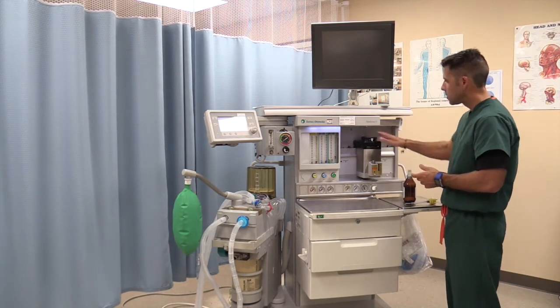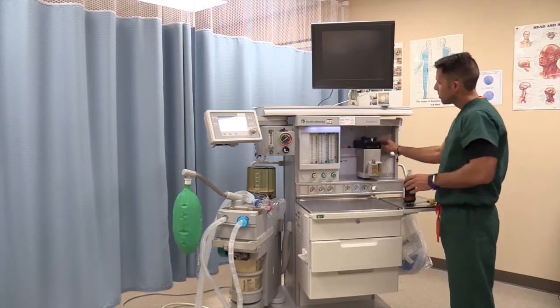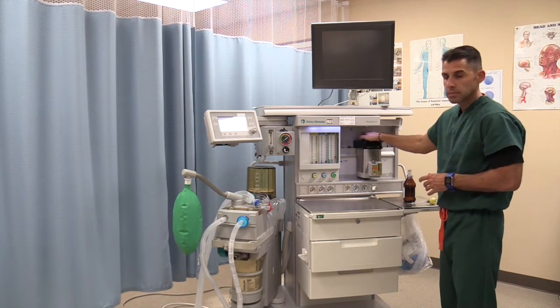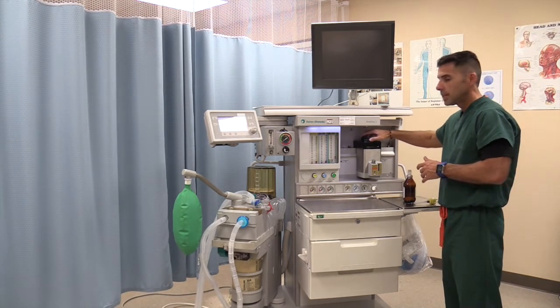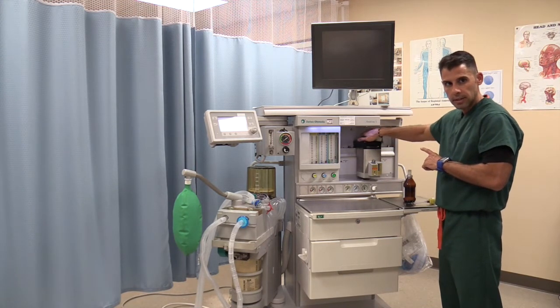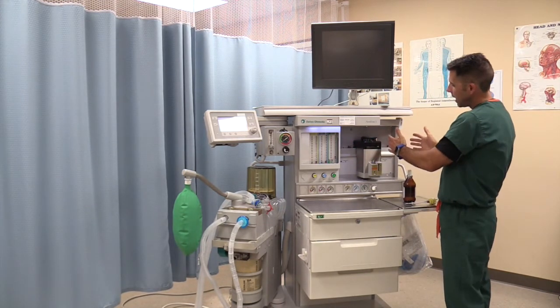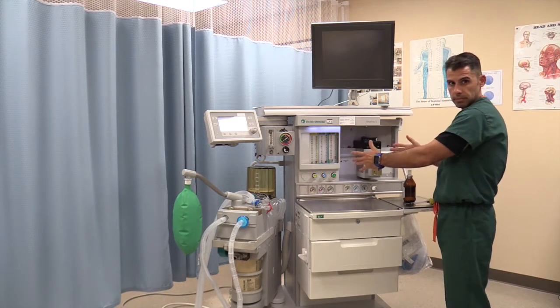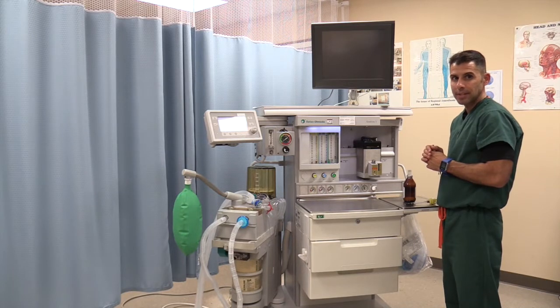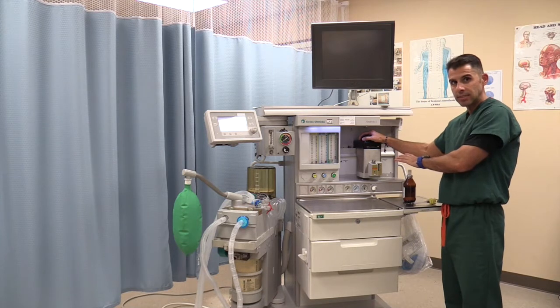In keeping with the anesthesia machine, once we lock the vaporizer, this is called an interlock system. It allows us to open the gas, and you will hear a little click every time you open it. Another safety feature is that it will not allow you to turn on more than one vaporizer at a time — only one vaporizer can be on at a time. In the mornings, one of the things you check is trying to open two vaporizers at the same time to verify that interlock system.